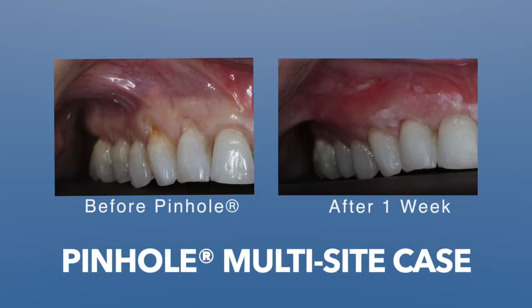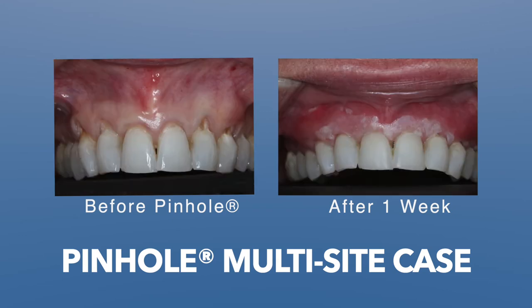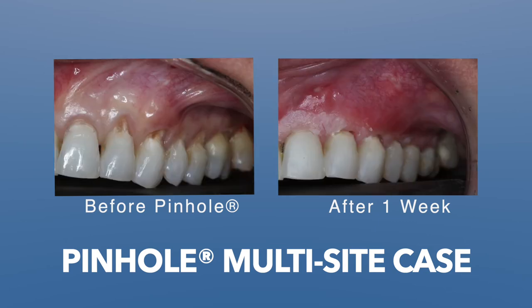You have the tools to take them all on and achieve this result. Now let's show you the after result — you'll see how nice this looks at one week — and we look forward to showing really great results at week three and six weeks when we present this case again.